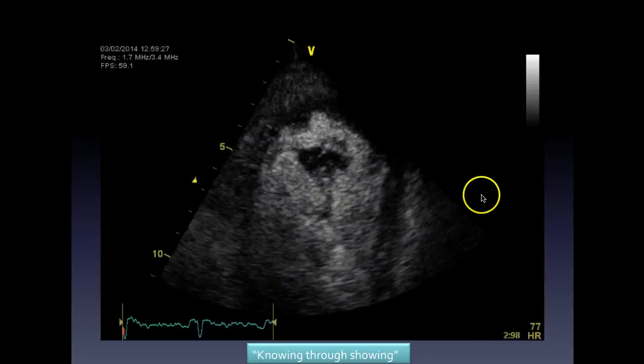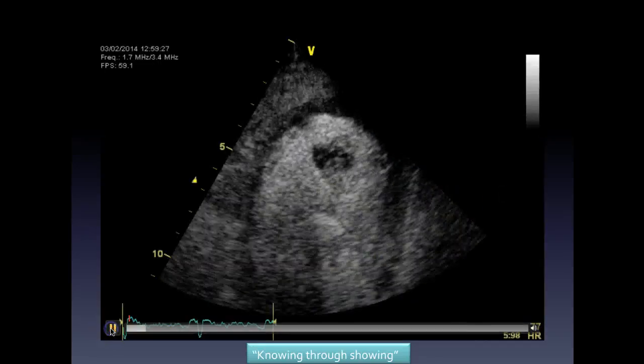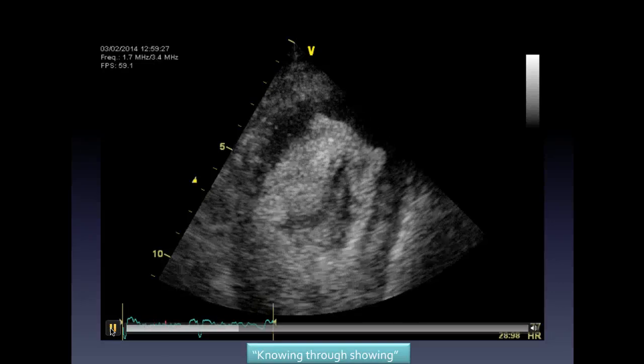Would you wheel him down to the MRI scanner? Well, you petition, you get a letter from the Pope to get to the MRI scanner for a cardiac MRI. So, yeah, good idea. So, use contrast. Now, this is a contrast chart. You happier now? So, it probably doesn't go through.